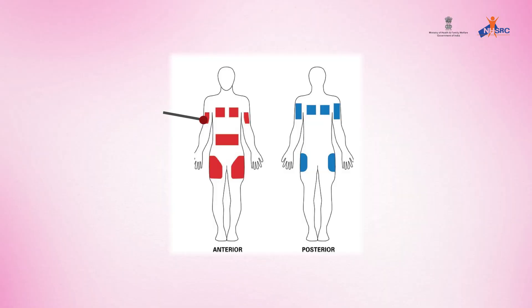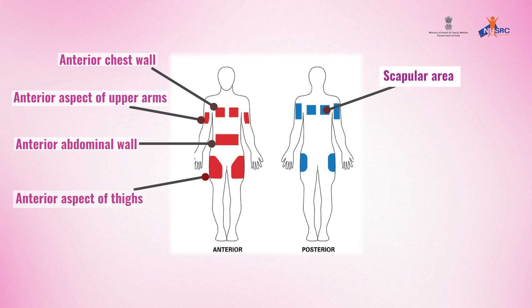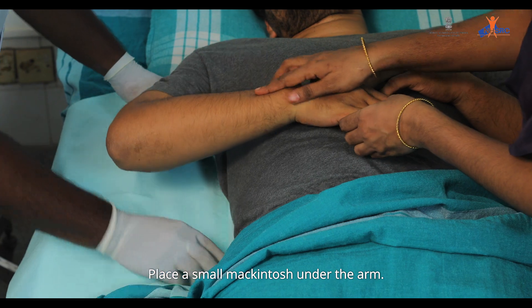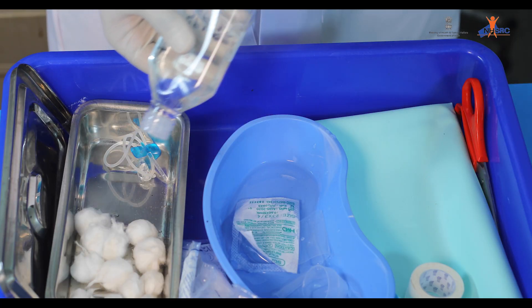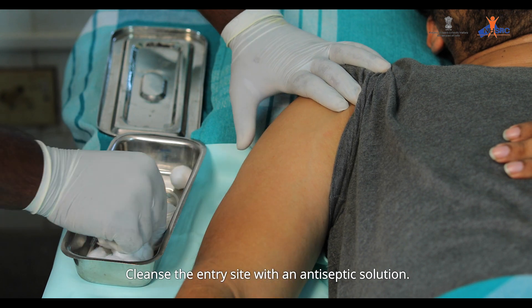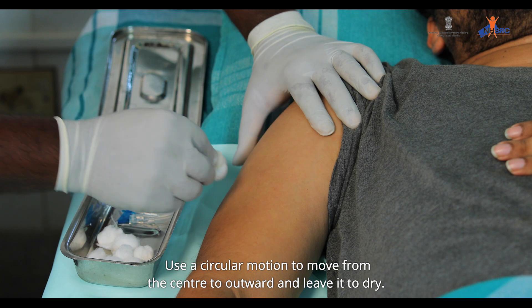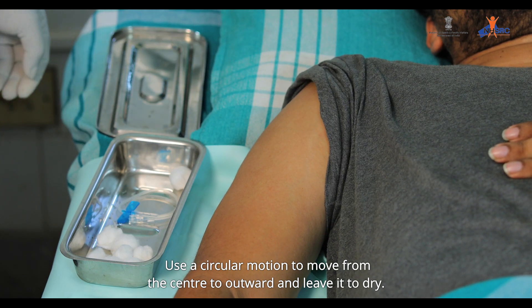Provide a comfortable position and select the site — suitable sites include the anterior aspect of the upper arms, anterior chest wall, anterior abdominal wall, anterior aspect of thighs, and scapular area. Place a small macintosh under the arm. Cleanse the entry site with an antiseptic solution using a circular motion from the center outward, and leave it to dry.